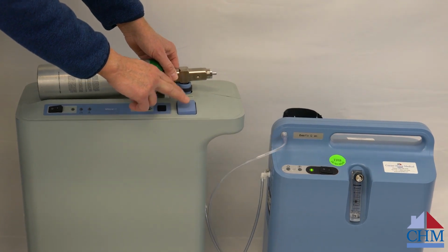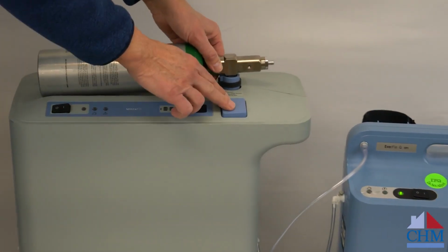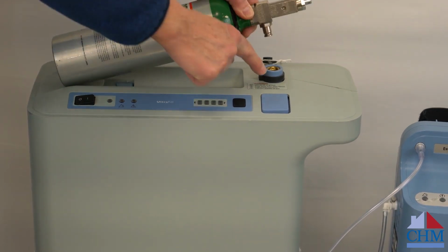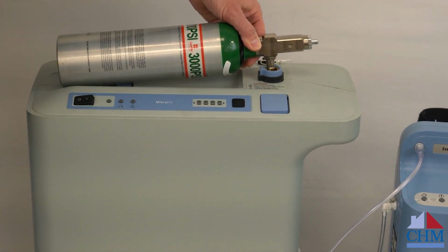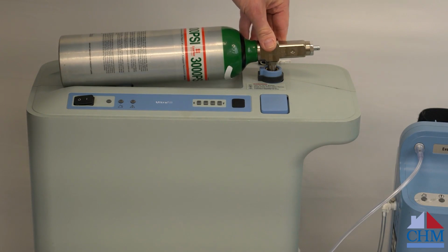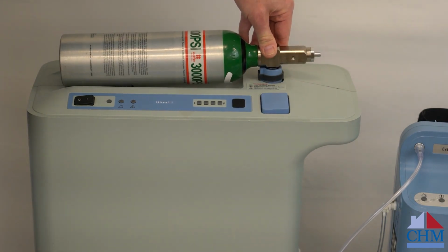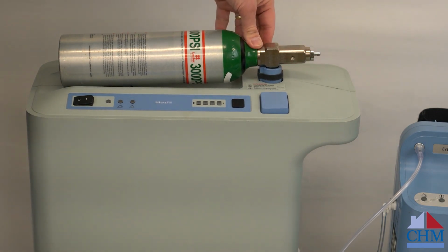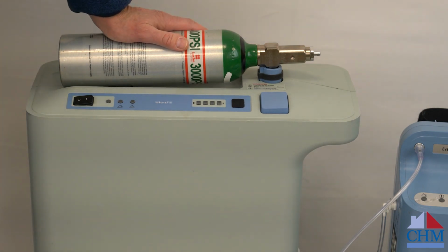Then you can go ahead and attach your tank. I'm going to go ahead and release it by pushing this release button here just to show you how it attaches. So this stem goes into the socket here, and I just need to set it in place and push down, and it locks. Now in order to check it, you can just pull up on the tank, make sure that it's locked into position, and then we can go ahead and fill the tank.